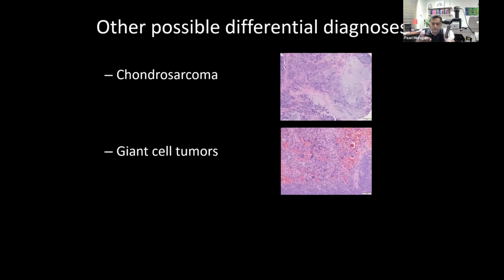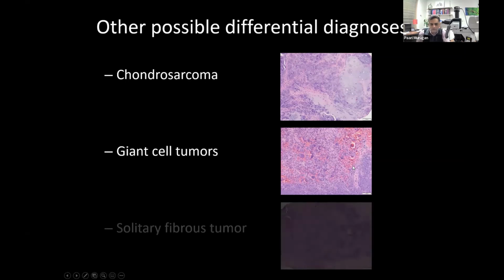And then we had areas with multinucleated osteoclast-like giant cells. So maybe it was a giant cell tumor of the bone that was somehow not present in the bone. It was present in the soft tissue adjacent to it. Seems a little bit far-fetched, but at least from this morphologic picture, that may be under consideration.